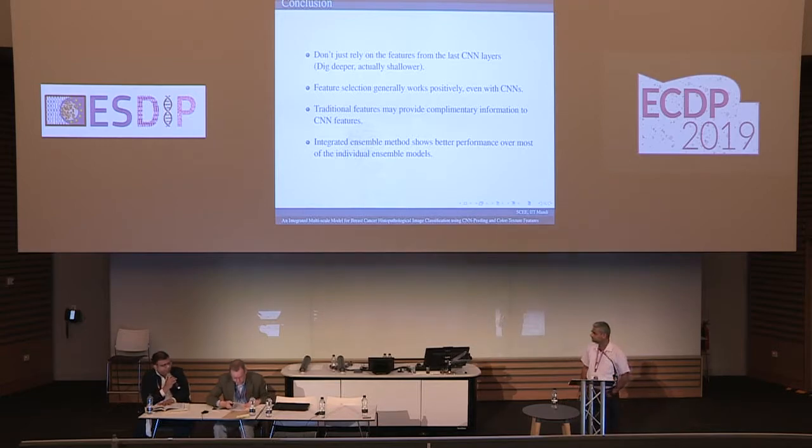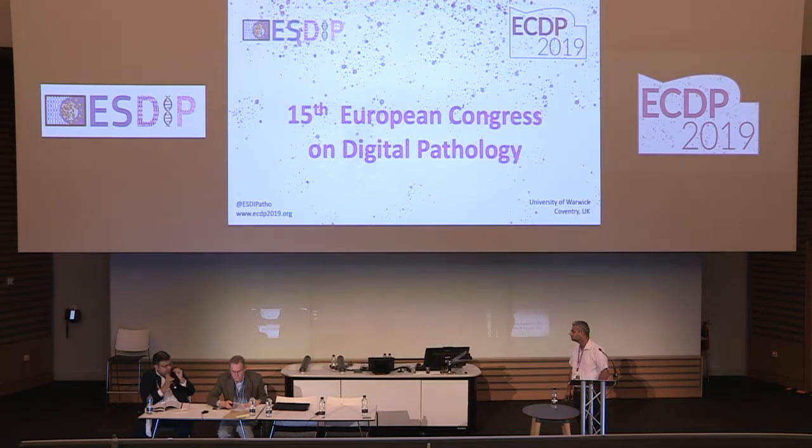Did you find any problems with color normalization and the variation in the color stains? Did it affect your performance across the cases? Right. Because this is a standardized data set, the data set is reasonably normalized with respect to the color scheme. Now that we will work on more realistic data sets coming from hospitals and so on, we will have to check that.